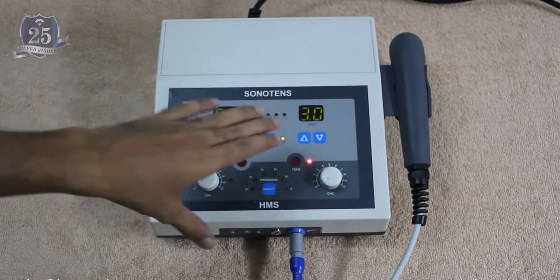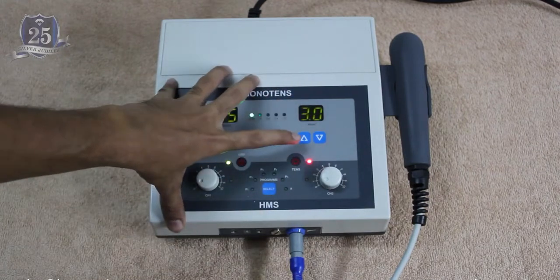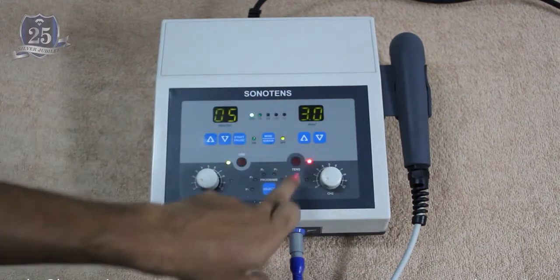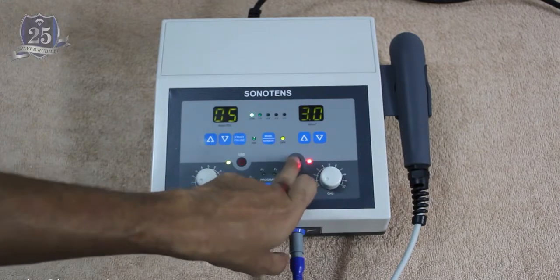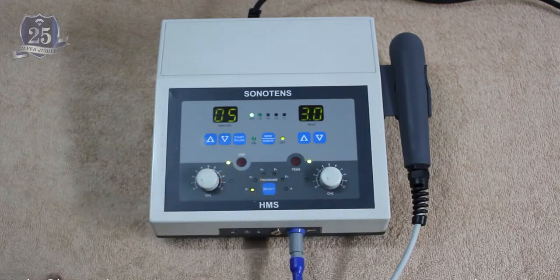So you can also give the combination therapy with the TENS. Now the ultrasound is in on state. We'll be switching on the TENS now. So this button over here is used to switch on the TENS. Now the TENS is in on state.